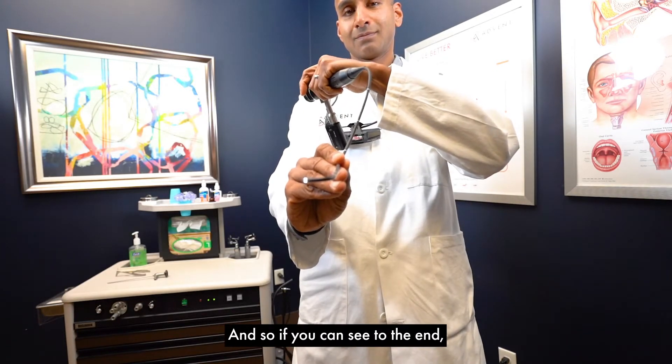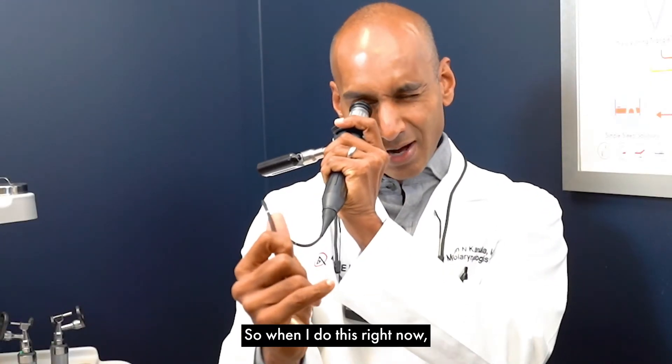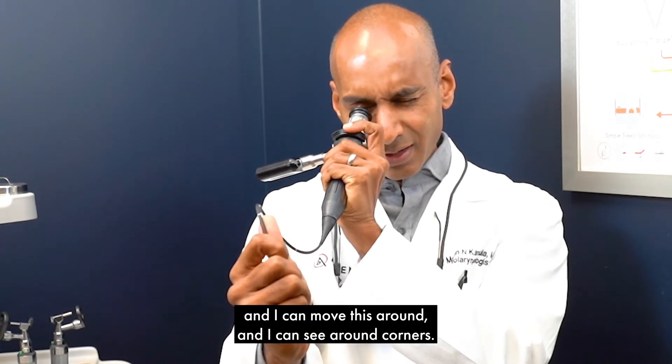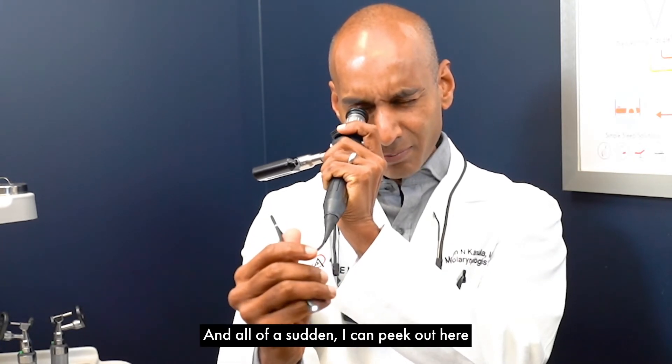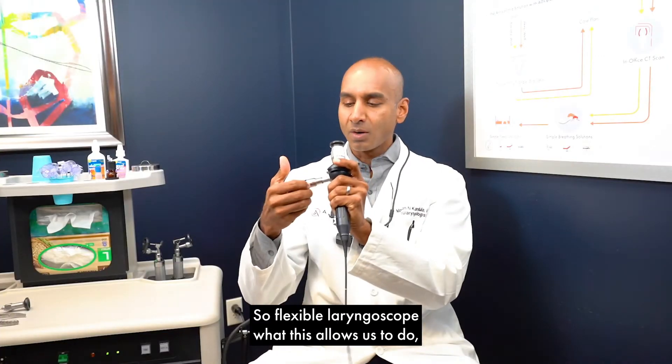You can see that little white light shining at you from the end. So right now I can see the inside of my hand — I can move this around, see around corners, and peek out wherever I need to. So that's the flexible laryngoscope.